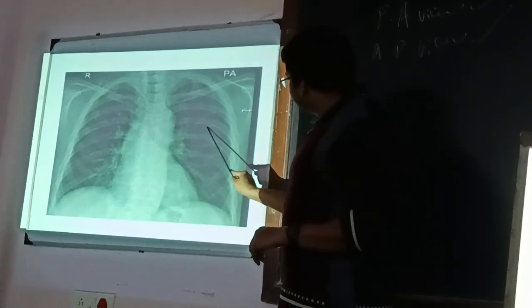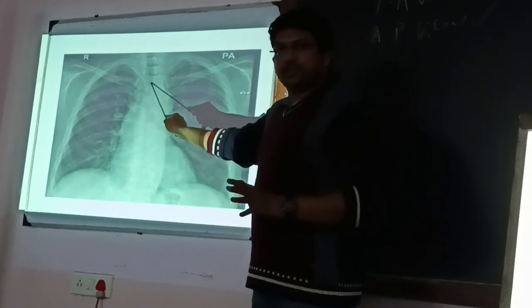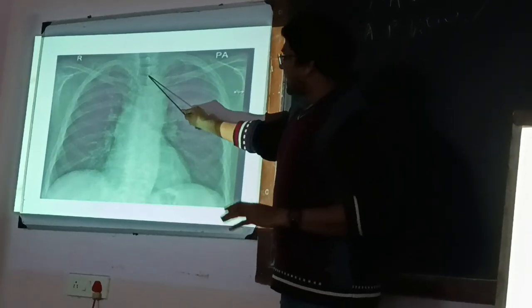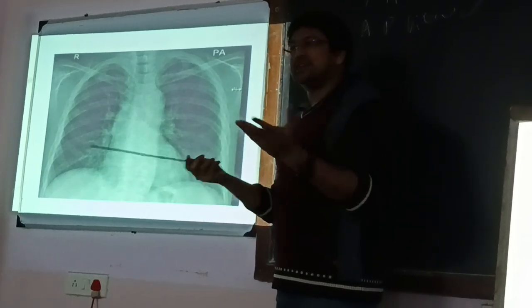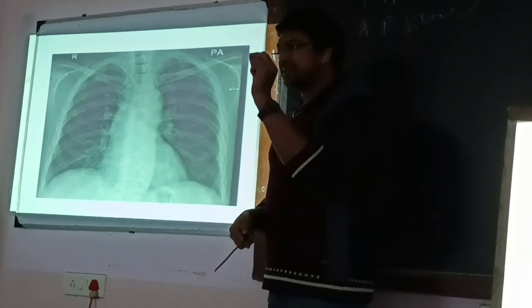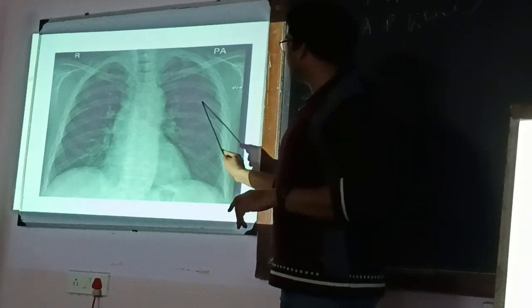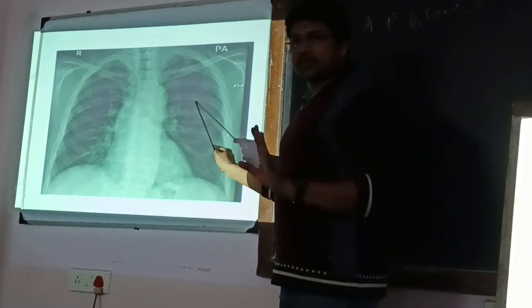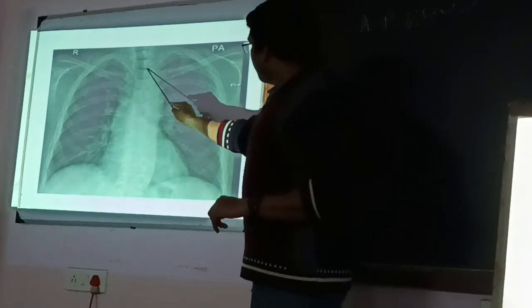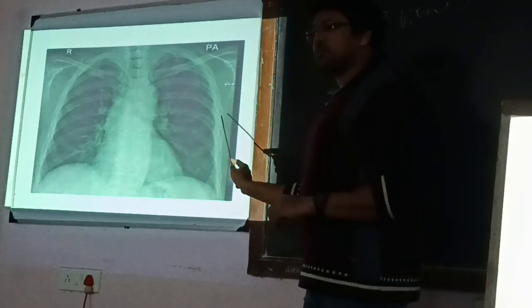Are you able to see that? This is more darker in color compared to this one. This is grayish in color. So this can be carrying the X-rays, but to some extent. That means few X-rays will be passing and few X-rays will not be passing over here, because it is a semi-solid structure. But lungs will be carrying all the X-rays, so it appears blackish in color. And bones not carrying the X-rays, so obviously whitish in color. Skin also appears in this manner, and fat also appears in this manner, wherever the skin is present or fat is present.